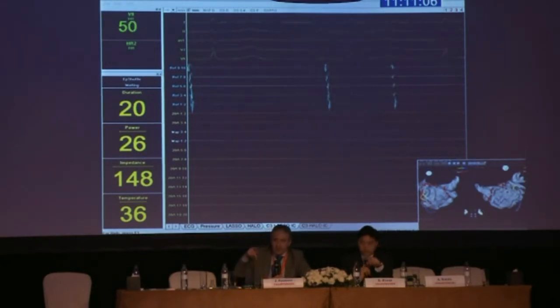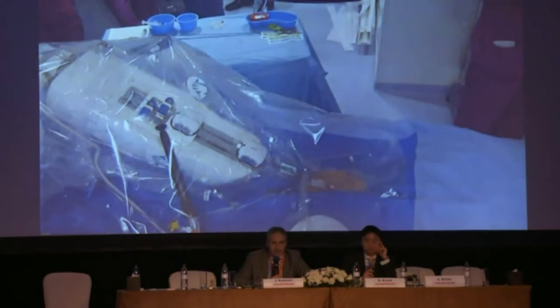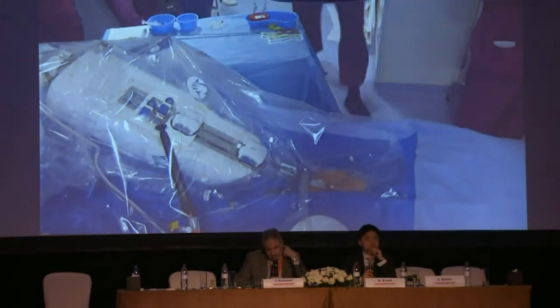There is one question. Hey, Richard, thanks. This is Haran speaking. Beautiful case, very impressive. I'm just asking you a question regarding the point that got you back into sinus rhythm. You didn't really map the atrium very much, so how come you chose that point? I can understand that you're looking for rapid firing, but how do you know where the fastest firing point is without really mapping the atrium?